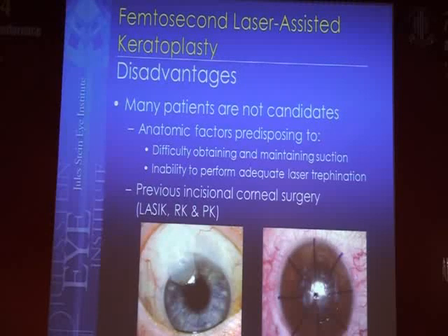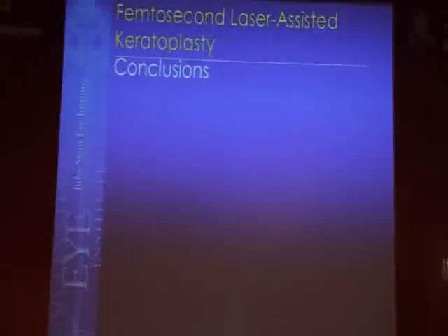And I tend to avoid doing this in patients with previous incisional corneal surgery, where I have to cross the incisions, such as patients with previous RK surgery or previous penetrating keratoplasty.